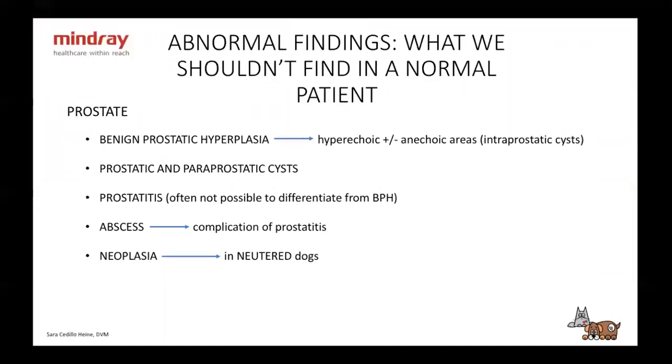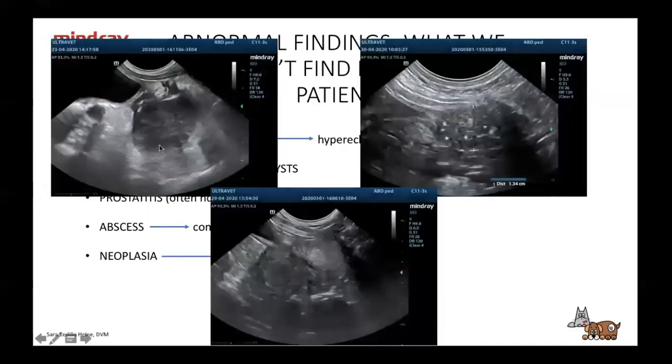With the prostate, we can have benign prostatic hyperplasia — a hyperechoic prostate with or without anechoic areas that are intraparenchymal cysts. You might see prostatic and paraprostatic cysts, prostatitis — which is often not possible to differentiate from benign prostatic hyperplasia — abscesses as a complication of prostatitis, and neoplasia which is usually in neutered dogs. Here we have an abscess, a small cyst, a large abscess, a dog with Cushing's disease showing prostatic calcifications, and benign prostatic hyperplasia.